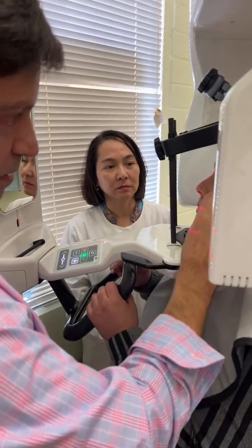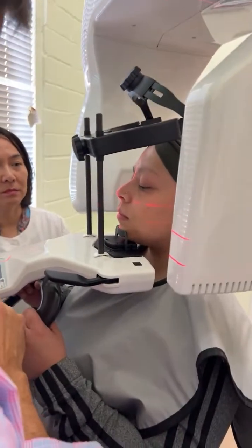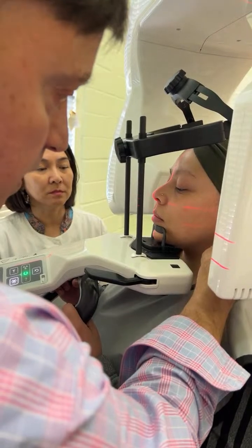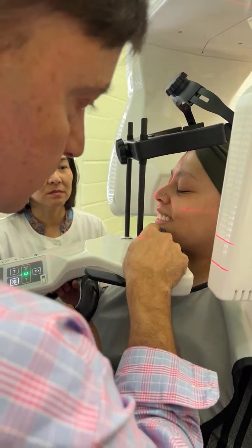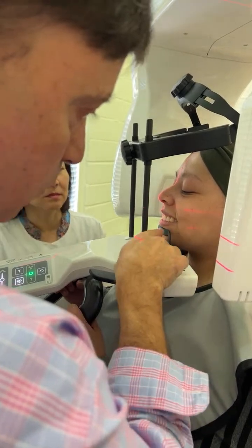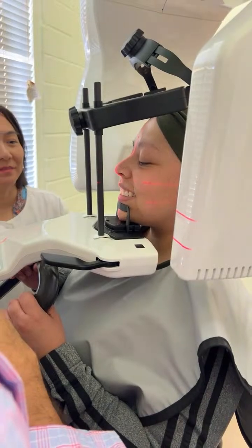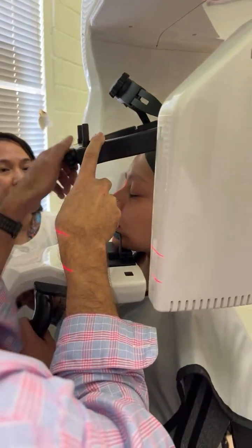Okay, we're up here. See that? I can even go up a little more if I want. This head moves up, so she's under that and on the chin. Okay, smile. That lower light is hard to see, but it's probably right about in there. Good. Okay, so now we can start to get the head support right.